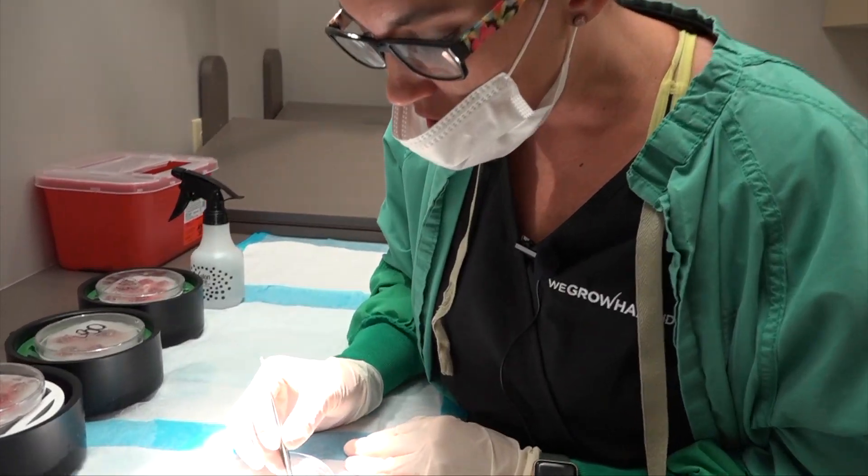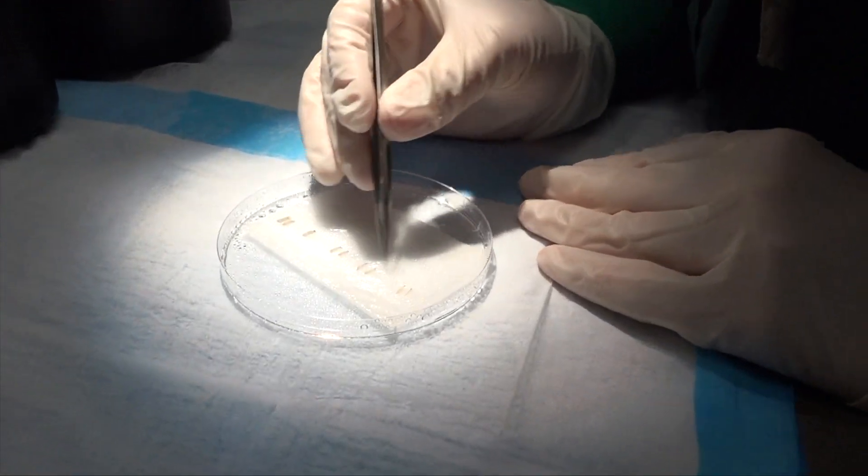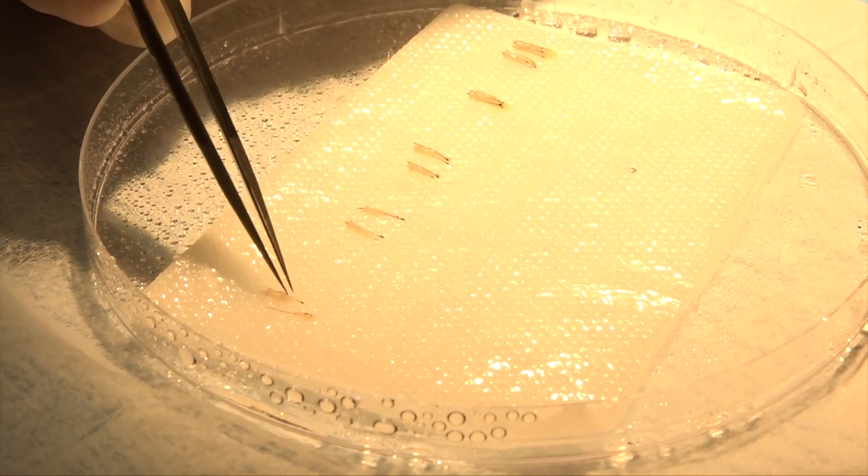So after the extraction and the harvest has been complete, we check the grafts for quality, and as you can see we have some single follicle hairs.